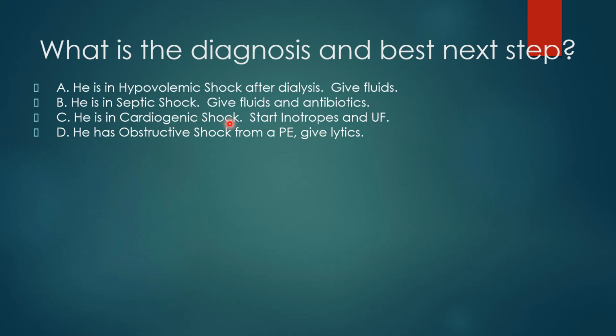I have someone who has a calculated low cardiac output. Now, in septic shock by itself, if you had relatively preserved cardiac function before, your cardiac output will be normal to high usually. But again, that's an overly simplistic example, which in real life may not be so, but on a test you'll probably get a higher cardiac output unless they have an additional septic cardiomyopathy. So I have likely high left atrial filling pressures. I have a low cardiac output. C has moved up very high on my differential, right?